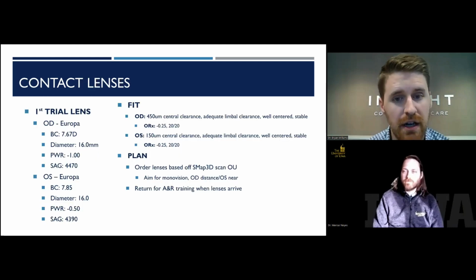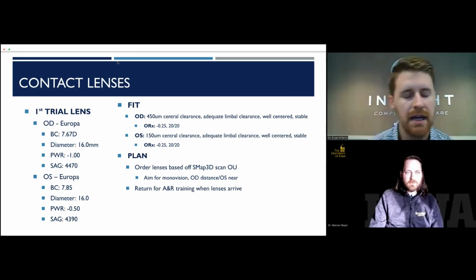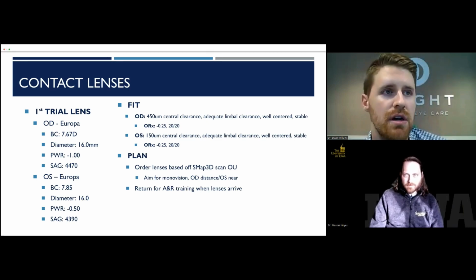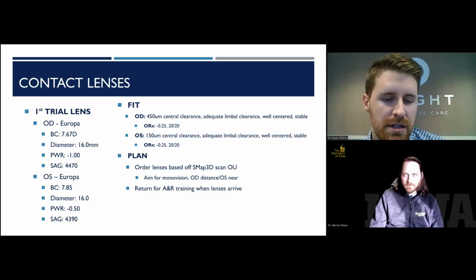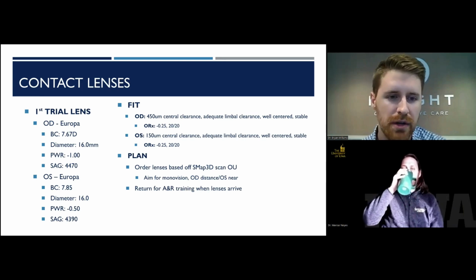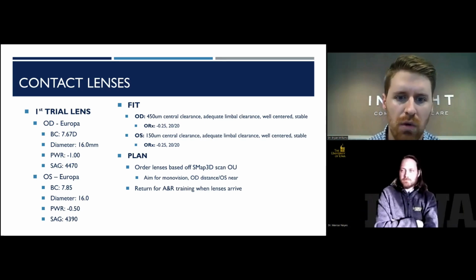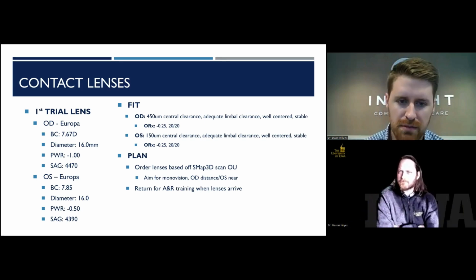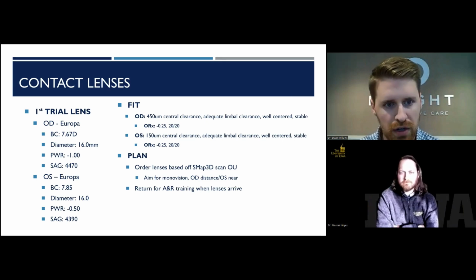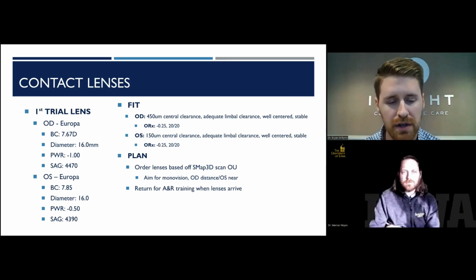So this patient is another one that opted for an SMAP scan. I usually tell patients if I think that an SMAP would be well worth the investment. Not only was she driving a bit of a way, I think round trip for her was about an hour and a half each way. But with the small fornix that she was going to be working with, I was really concerned with being able to map out a good quality lens for her.